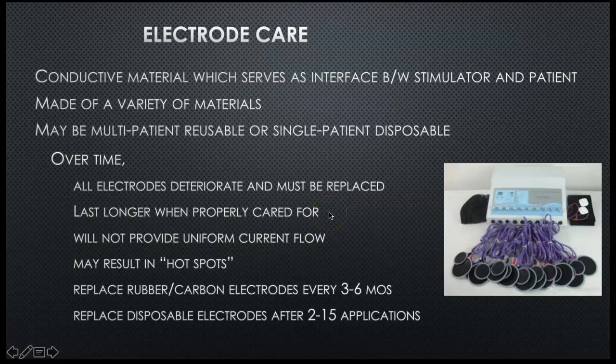So they'll last longer if you care for them properly. I will get on you about taking care of your electrodes so they last the whole semester. If they don't stick, they don't provide uniform current flow, and you can get hot spots. So you really want to make sure that they are sticking, and you can learn some tricks in lab for how to make them stick if they're not sticking well.